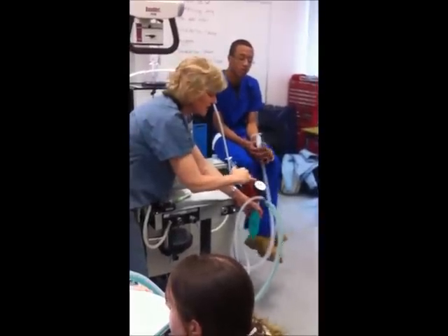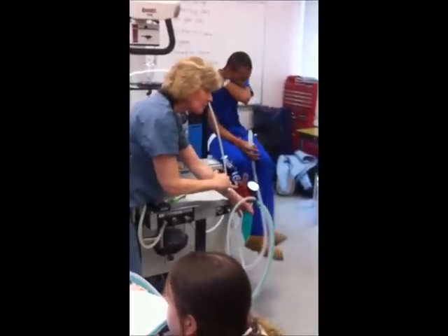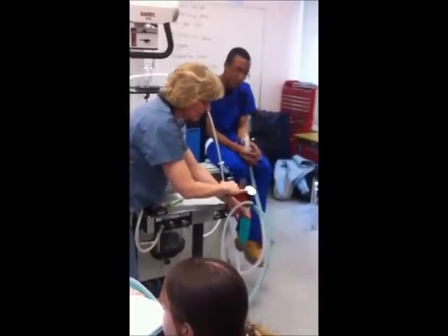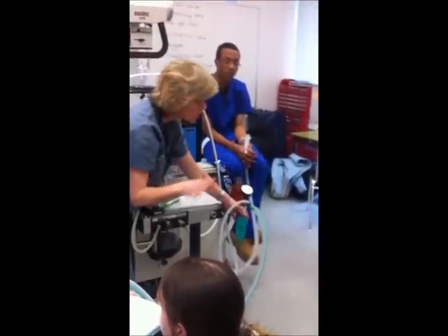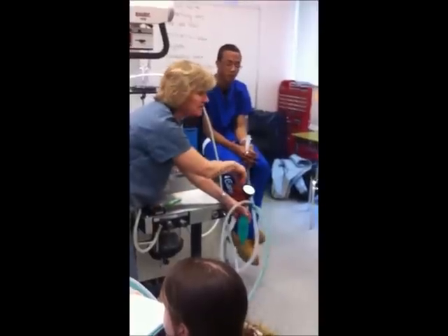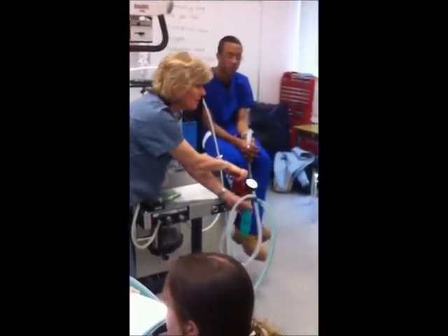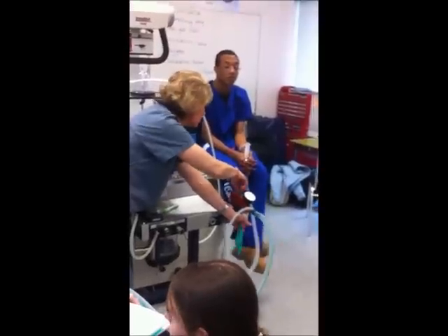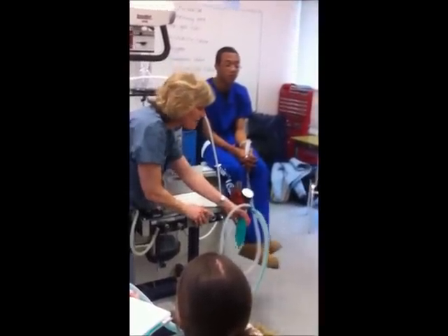When you get into further studies, how much you squeeze in there is important too. And I use this little, what's called a manometer. I'm not going to go over 20 centimeters of H2O. You don't need to know that for a test, but just understand I'm teaching you very basic. Close, squeeze, open. Close, squeeze, open. That's called bagging the animal.